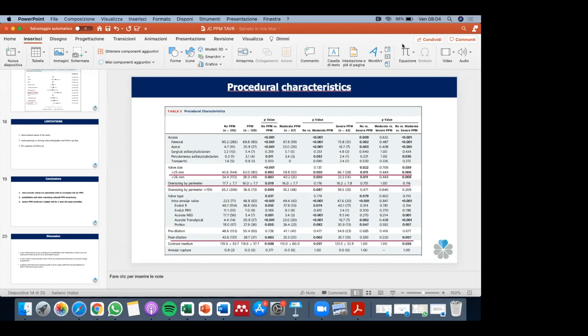Yeah, just something to add. Agree once again with Damiano. This is because we worked for many years together. If you oversize with a self-expandable valve, what is crucial is to do a very high implantation. Otherwise, if you do a standard implantation, especially in valve-in-valve, just because your TAVR is larger, you do not have a standard movement of the leaflet. So what you risk is a higher gradient, because the leaflets do not open properly, but you also risk intraprocedural aortic regurgitation, prosthetic regurgitation, just because you don't have a right closing of the leaflet. So it's fine. You can think about oversizing sometimes in patients at very high risk, but just if you can reach a high implantation.